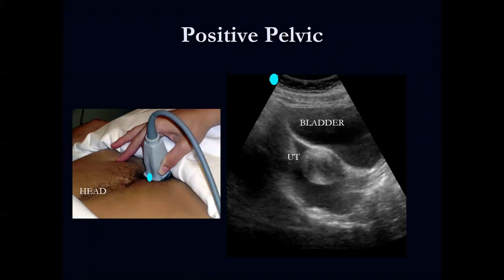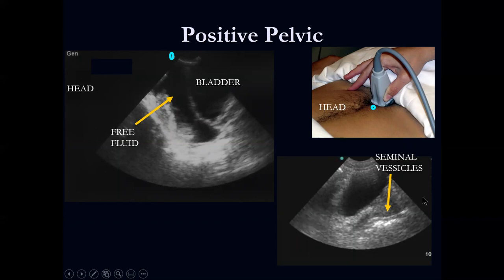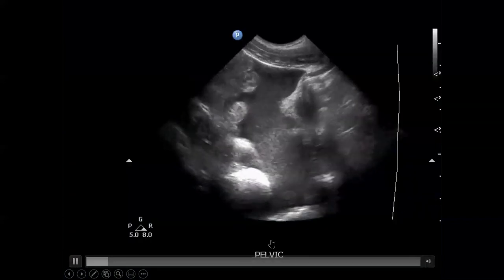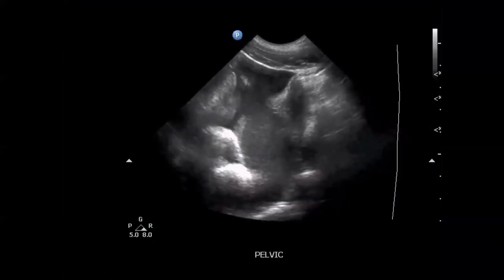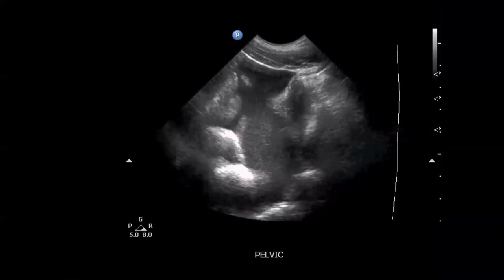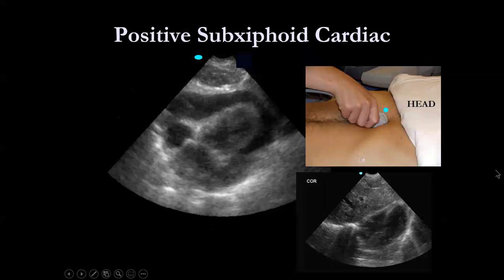For the pelvic view in the sagittal plane, you can see fluid surrounding the uterus and edging up against the bladder. In the male view, you can see the fluid — maybe a little clot there, or a loop of bowel — don't confuse that with the seminal vesicles. Here's another example of a really positive pelvic view where you can see bowel floating in the blood. This patient had most of their blood in the pelvis with a ruptured spleen — a 10-year-old who came off his skateboard, walked around for a couple hours before feeling dizzy. He had a grade 4 spleen rupture and amazingly did well with just observation. You can also see that the blood has started to clot since it's a couple hours old.